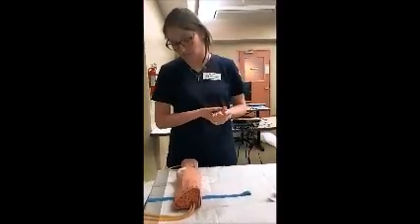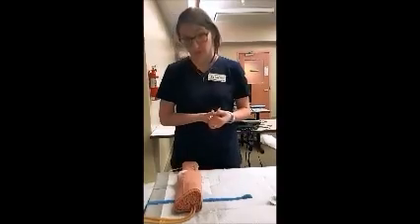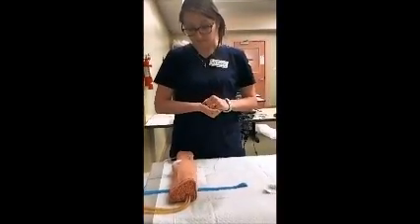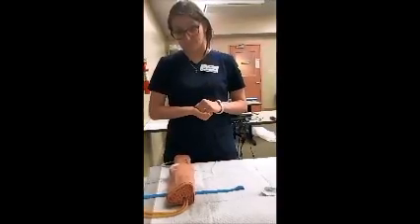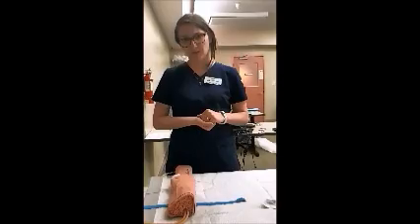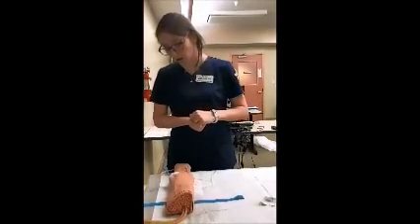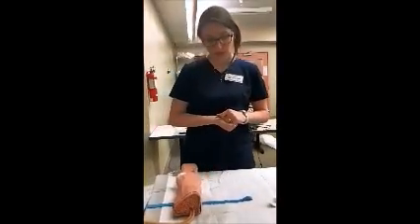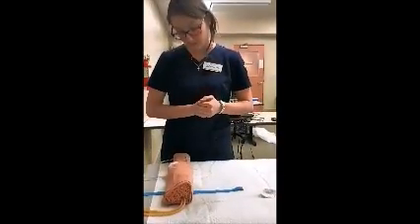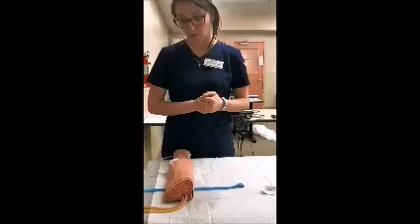What that means is that saline's not going in your vein. So we want it in your vein, right? Sounds good. And I do that with that button. Which button are you talking about? That red button. Oh, that call light. Yeah, that's how you get in touch with me. So if you see any of that, I want you to push that big red button and give me a jingle, okay? I'll come running, and I'll come check it out for you.